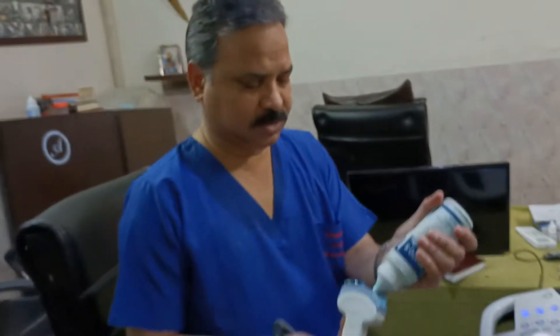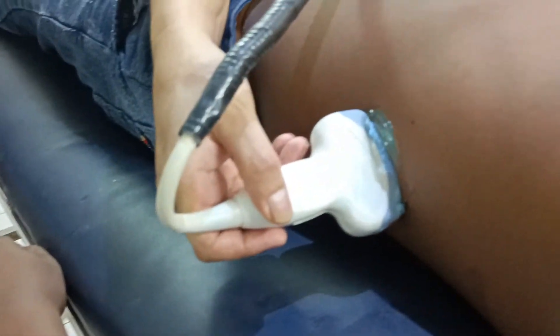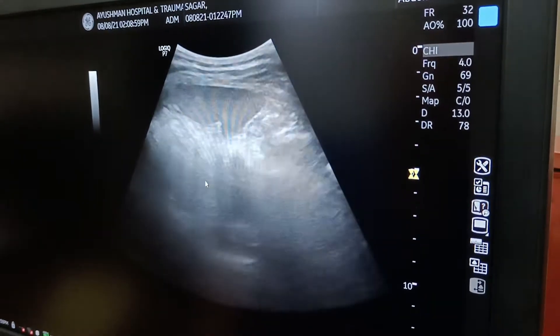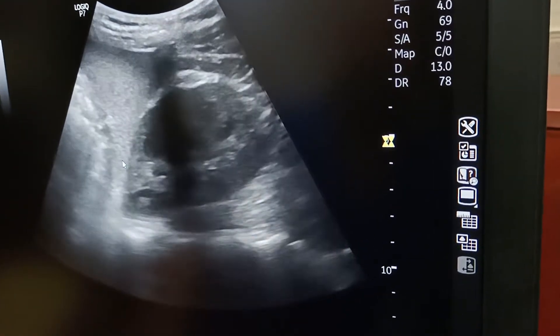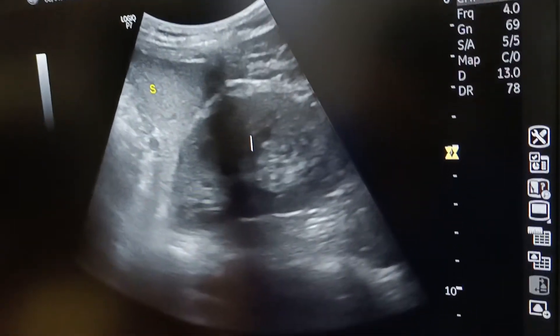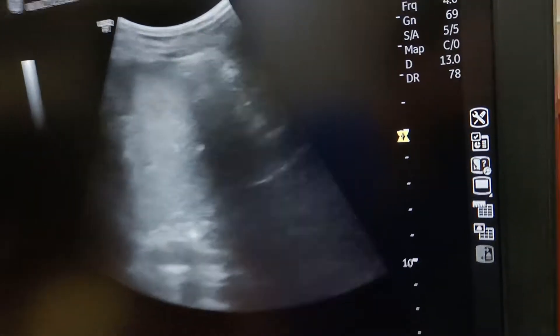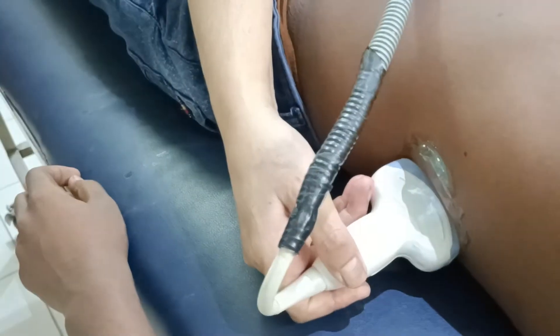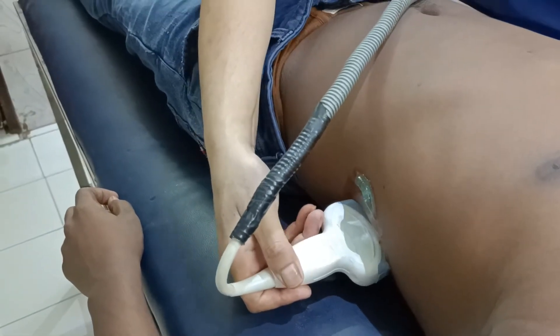Now coming to the second view — the left upper quadrant view. We will again keep the probe between the ribs to localize the spleen. You can see the spleen on the screen. We will again focus the kidney. The blood will get accumulated between the spleen and the left kidney. I recommend that you keep your hand on the bed when you are looking for blood between the spleen and the kidney, because it definitely gives a better view.